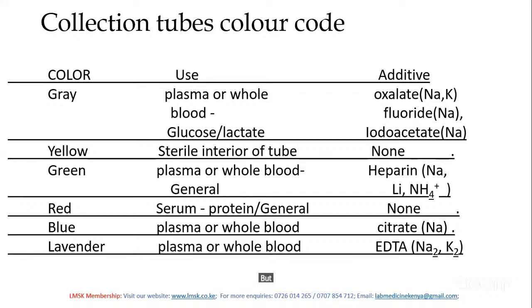But it also has sodium fluoride or sodium iodoacetate. These ones act as a glycolytic inhibitor. They interfere with an enzyme found in glycolysis called enolase enzyme.